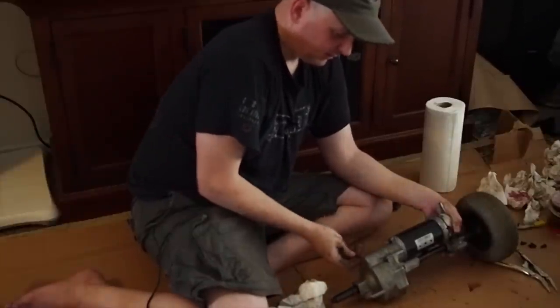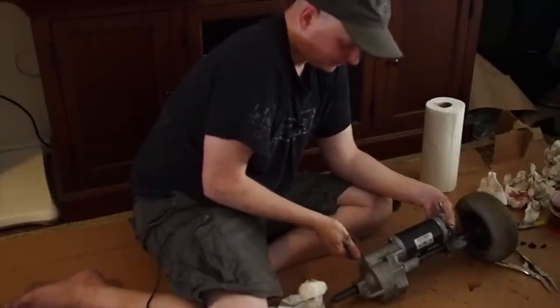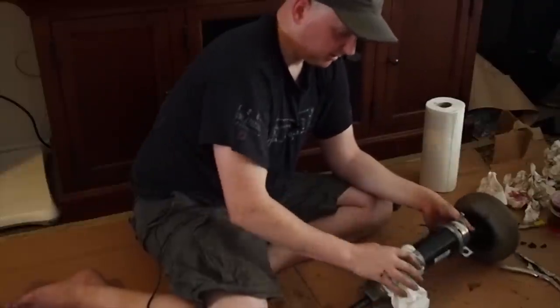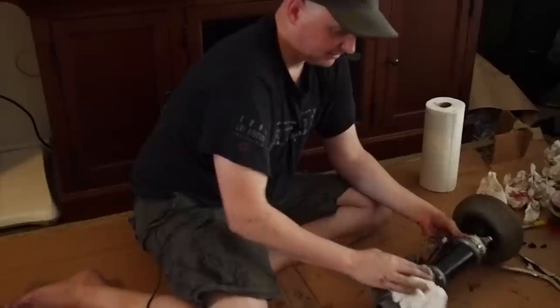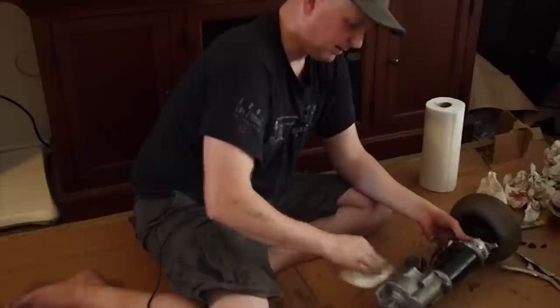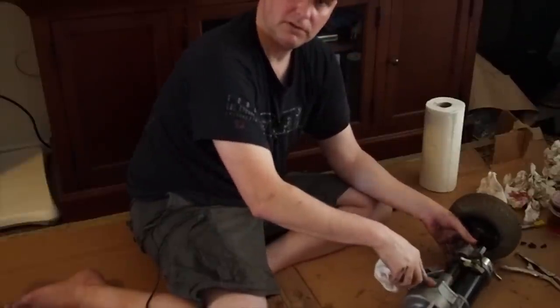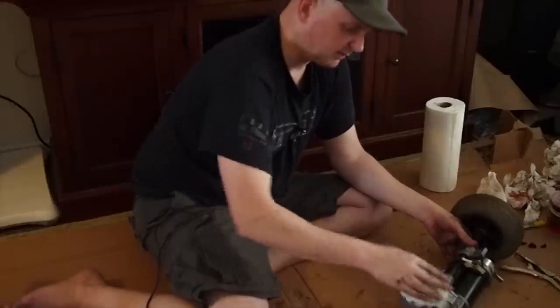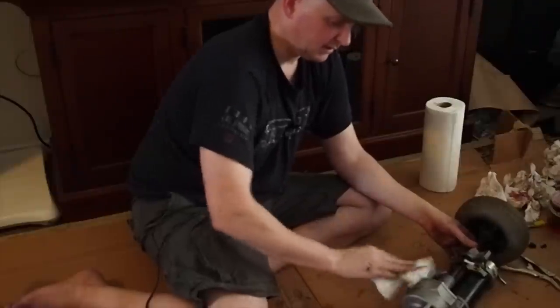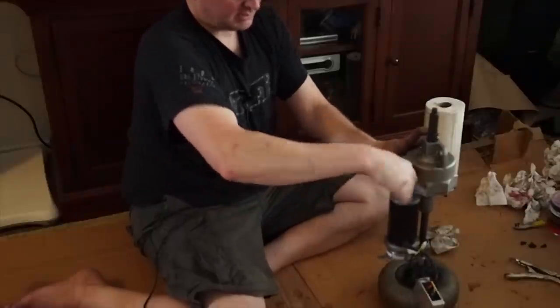Again, it would be nice to have instructions, and they probably do exist. Somebody who does this for a living could probably tell me, oh, you're doing it all wrong. And I'll say, well, yeah, but for the sake of going out and buying another one. How much do these transaxles cost? I think we saw them online for like $500. But like I said, I spent $20 for that one piece that's right there.